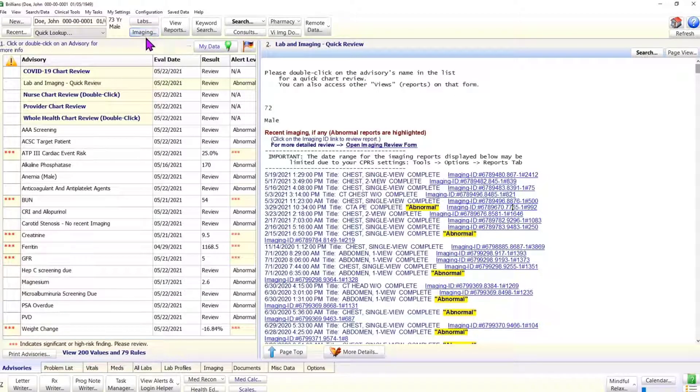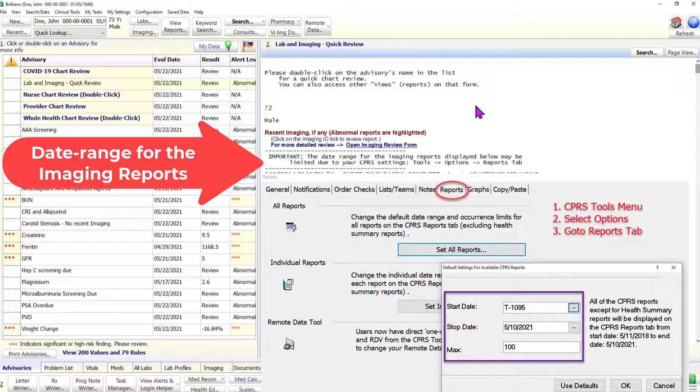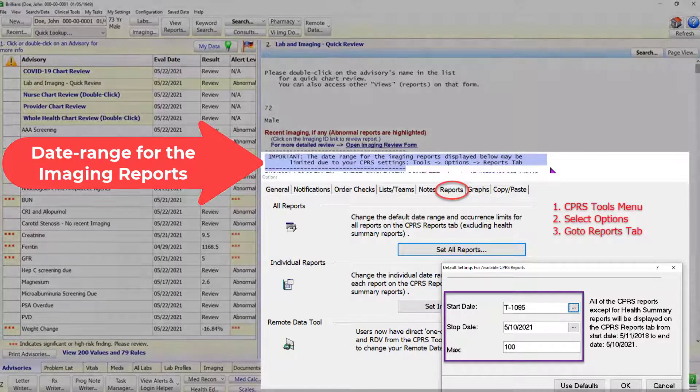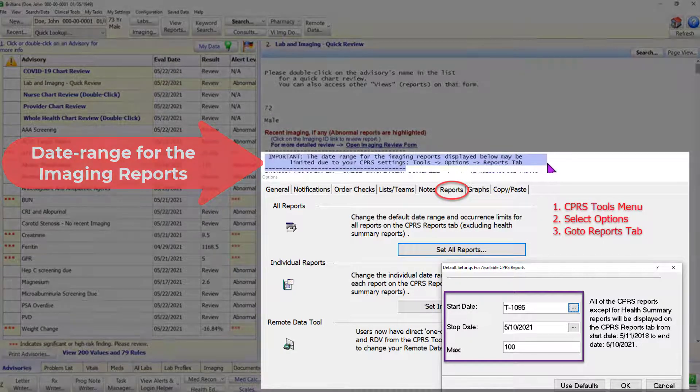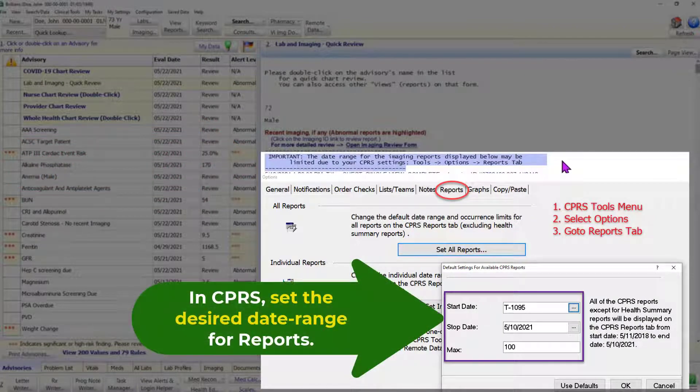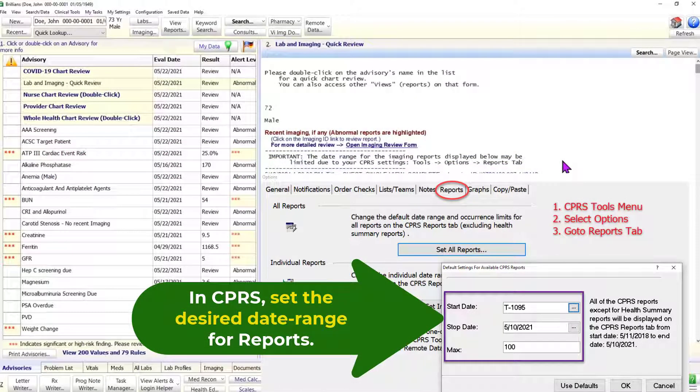It is important to note that the date range for the imaging reports displayed by the advisory is determined by your CPRS settings: tools, then options, then go to the reports tab. For purposes of this advisory, the recommended data range is past 3 to 5 years.